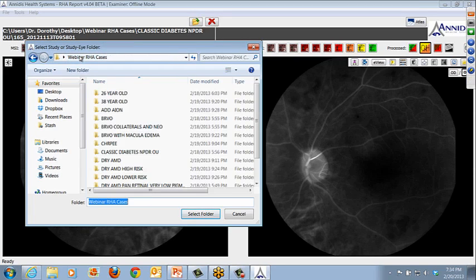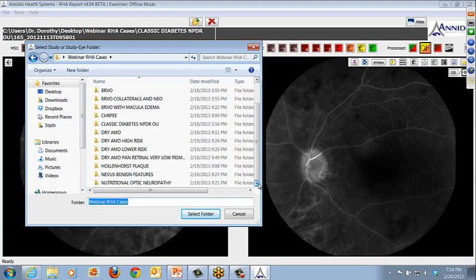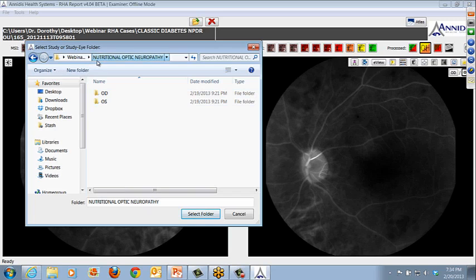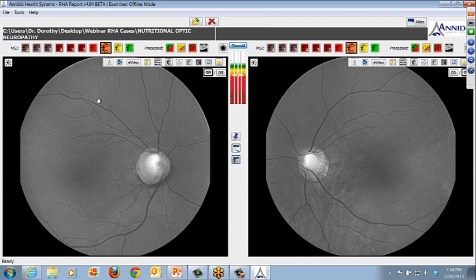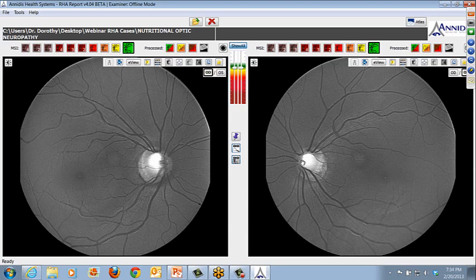And I'm going to pull up at least one optic nerve case here. Okay. So I have the answer and the diagnosis right there, but I think an obvious finding of, now this patient, I should back up and tell you a little bit about this patient. This is a 24-year-old female, again from my private office. She is a very low myope, -1.